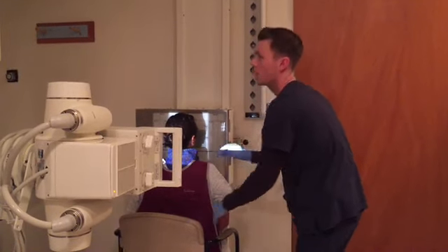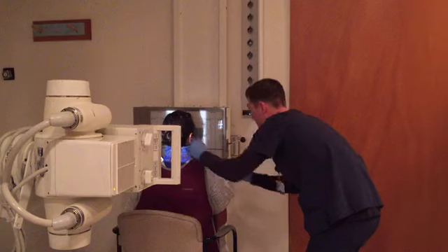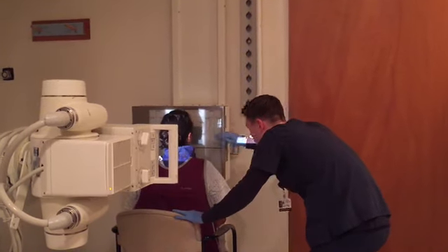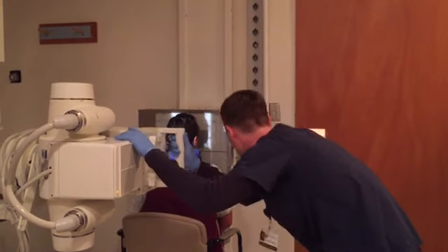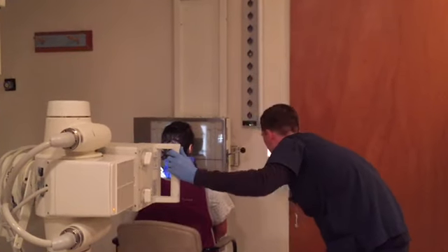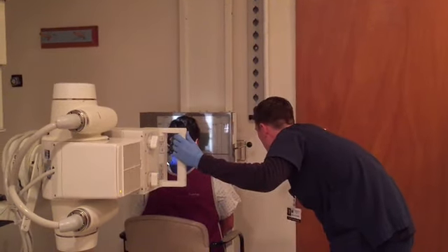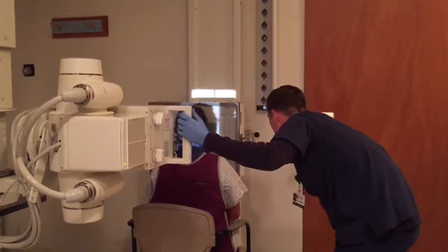And we want the OML to form a 15-degree angle to the central ray. So we're going to have her tilt her head back a little bit. Right about there, that's perfect. And the central ray exits the nasion. So, get a position for that. There.